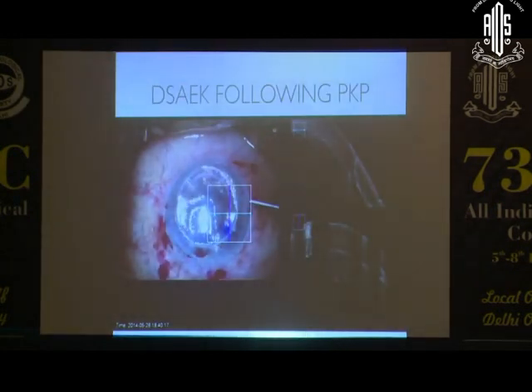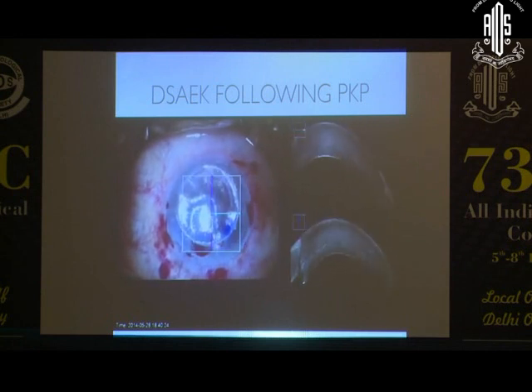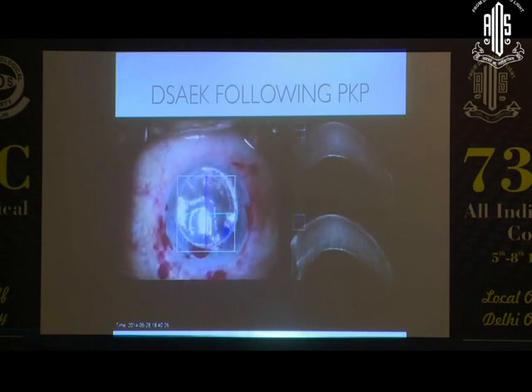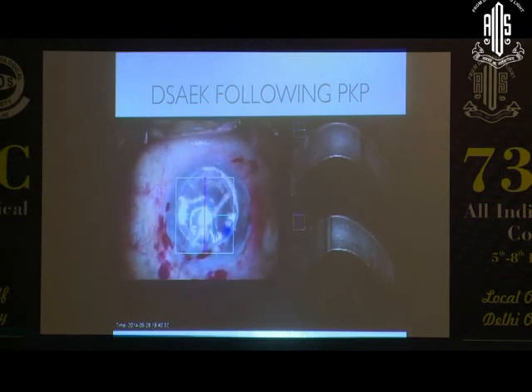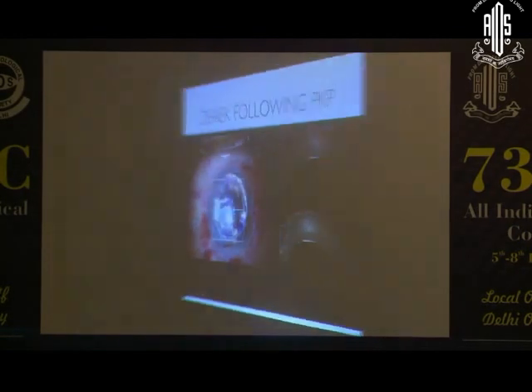Another additional benefit of this kind of an OCT is the fact that you can also look at the edge of your lenticule after DSEK surgery and see if it is apposing well to the cornea, and especially in cases following penetrating keratoplasty, if you're doing a DSEK, sometimes a posterior wound of the previous graft is going to raise your lenticule off the edge. So it's important to make sure that the edge is well apposed to your host cornea so that you don't have any chances of detachment.